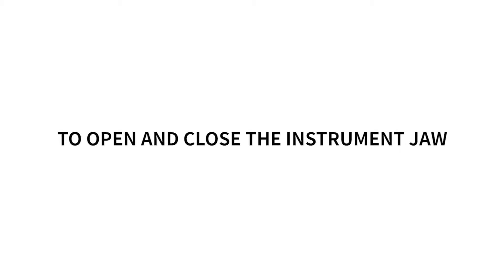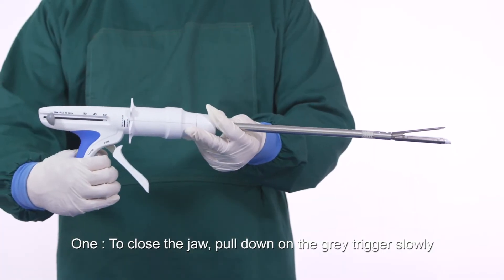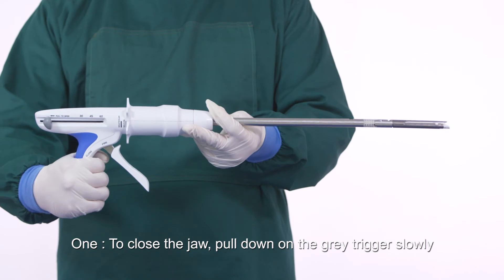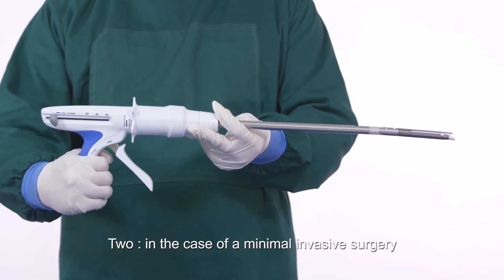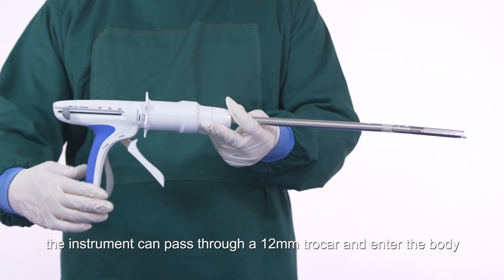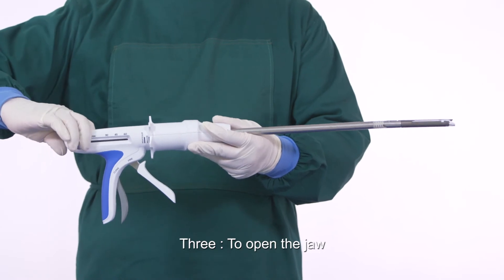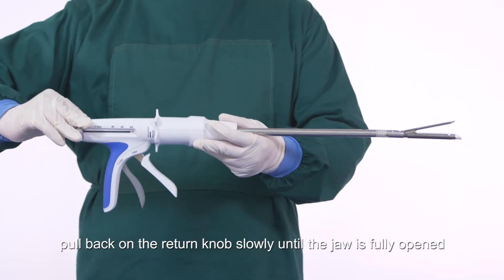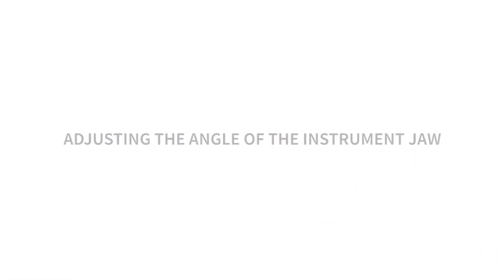To open and close the instrument jaw: to close the jaw, pull down on the gray trigger slowly. In the case of minimally invasive surgery, the instrument can pass through a 12 millimeter trocar and enter the body. To open the jaw, pull back on the return knob slowly until the jaw is fully opened.